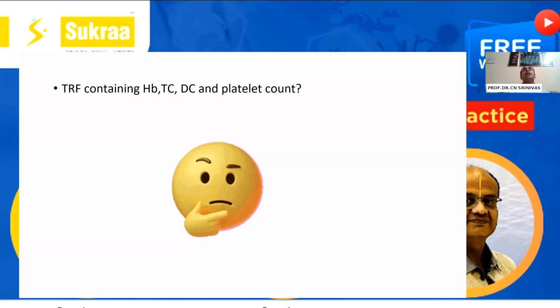Secondly, I think it's also on the camps. When you do a camp, you may want to have only a particular test, not the entire thing, because there are different modes as well. The instrument can run in a different mode. So probably that is the reason they will avoid a DC and go only for a total count or a platelet count. That is the second reason.